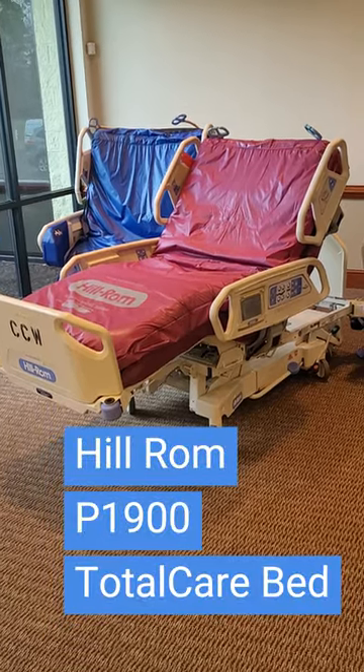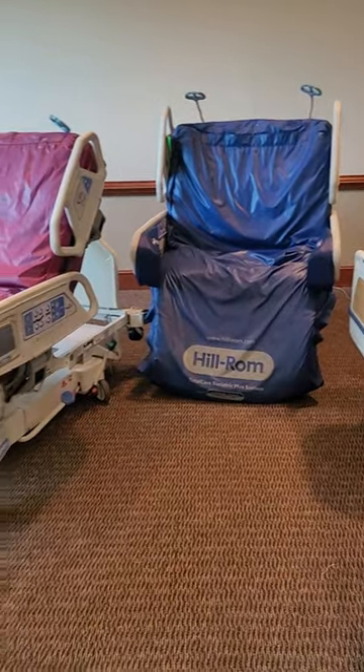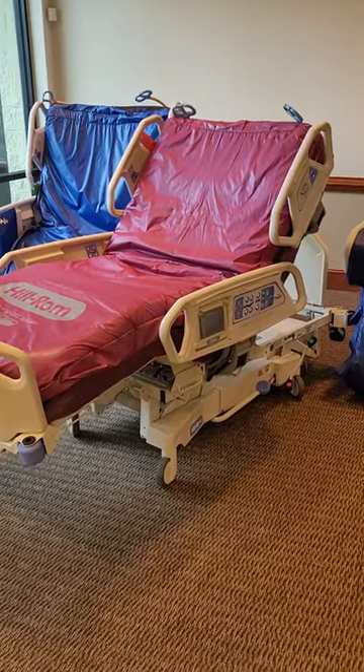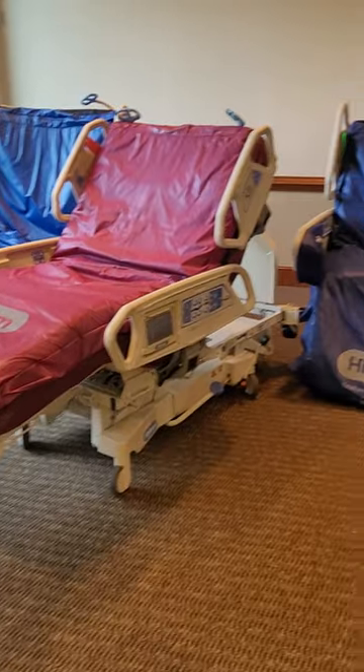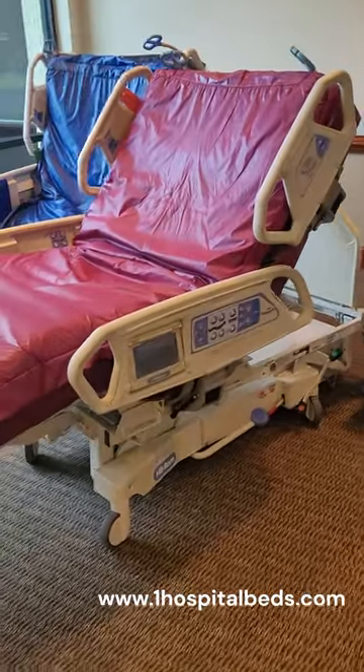We're looking at the Hillrom P1900 Total Care Sport 2, and right next to it, the Hillrom 1840 Total Care bed. Both these beds are the exact same beds. The only difference is that the P1900 is 36 inches — this one is extra wide at 40 inches, a little higher patient width.